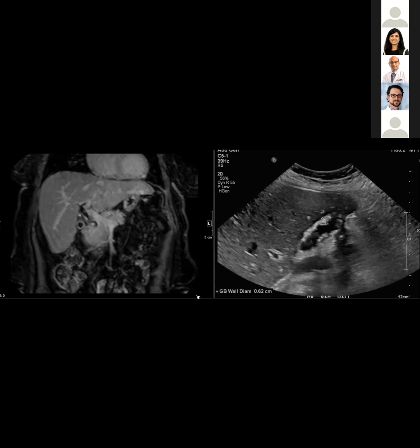And we have a critical number of sonographers that are able to mix the contrast, set up the software and obtain images. So obviously it's been a multi-year process to get to this point. But you got to start somewhere, right? You're going to have some growing pains as your volume increases. But I drag other radiologists and other sonographers into cases with me to teach them how to mix the contrast and check the images for quality.